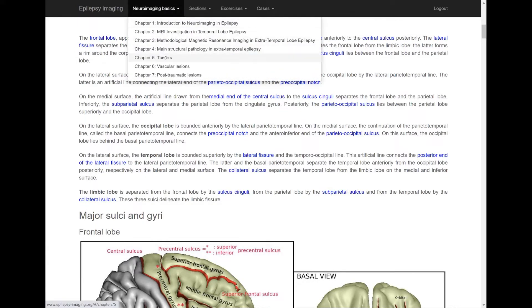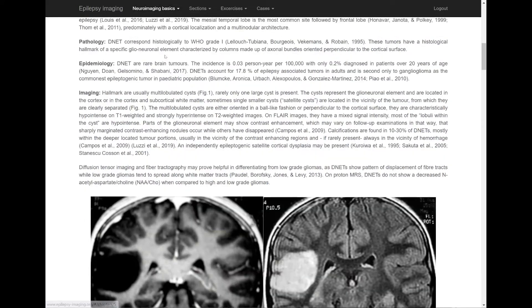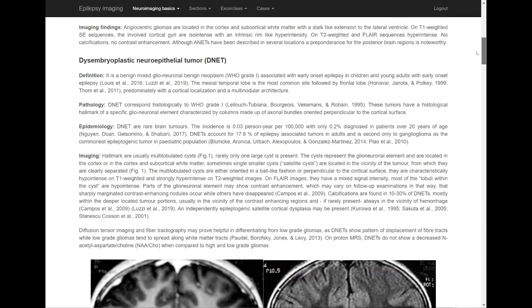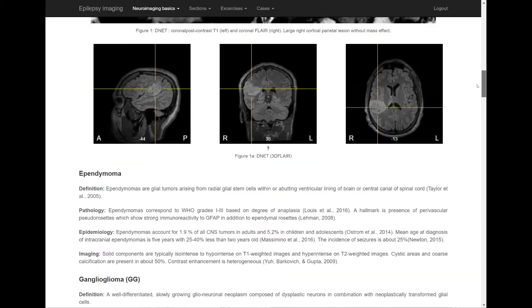In other chapters, for example this one on tumors, the MRI viewer is embedded into the text and allows inspection of the complete MRI.